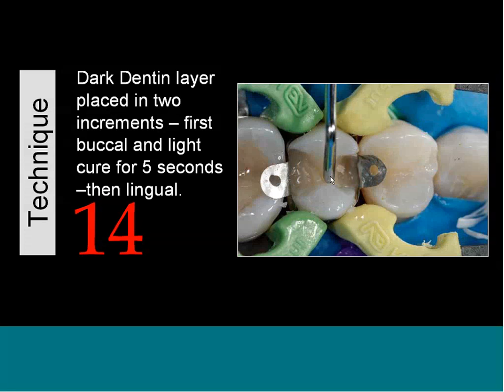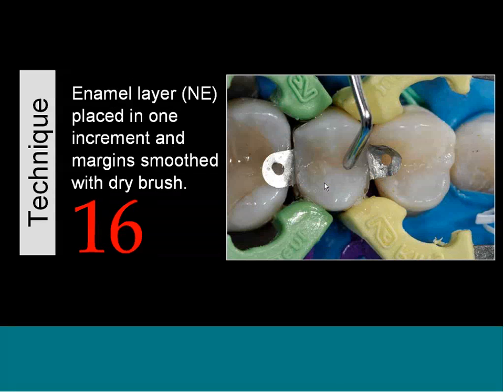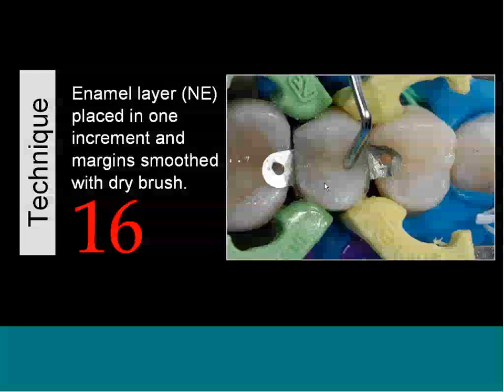So what I do, and here I use dark dentin like I talked about a couple minutes ago, dark dentin layer in 2 increments. So one on the buccal, cure it. One on the lingual, cure it. And then I left enough room for one layer of, in this case it's neutral enamel, the Reflections, and I place it in 1 increment. And I use a brush to smooth it off because that makes finishing minimal when you're all done. And of course this one was done with Reflections as well beforehand.